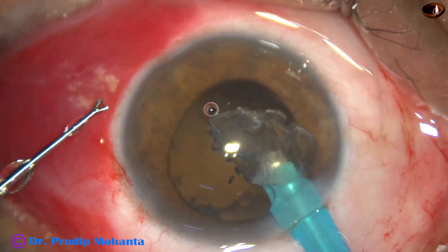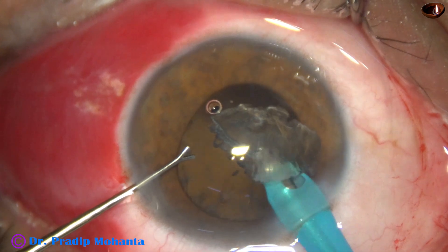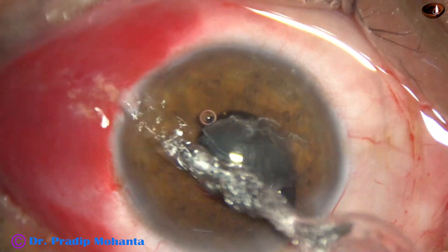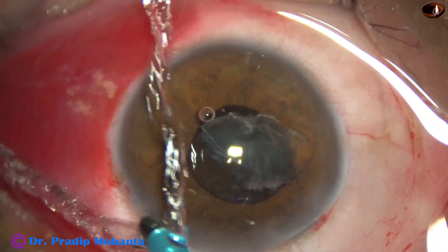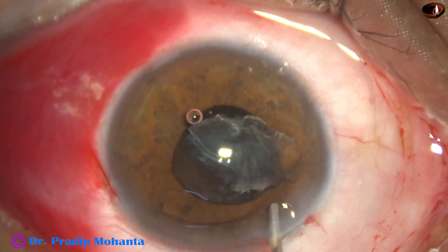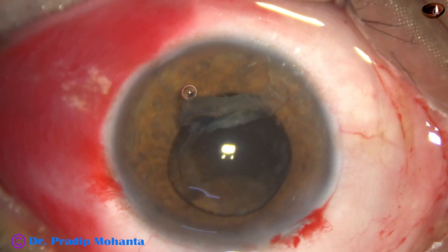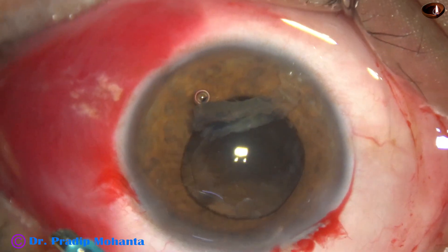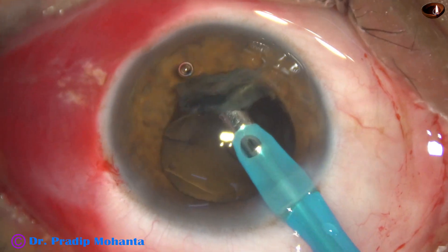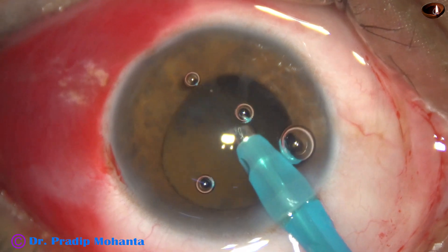But a portion of a piece is stuck to the cornea. So I inject visco and move this lens matter inferiorly. Then I go again with the handpiece only and remove this lens matter.